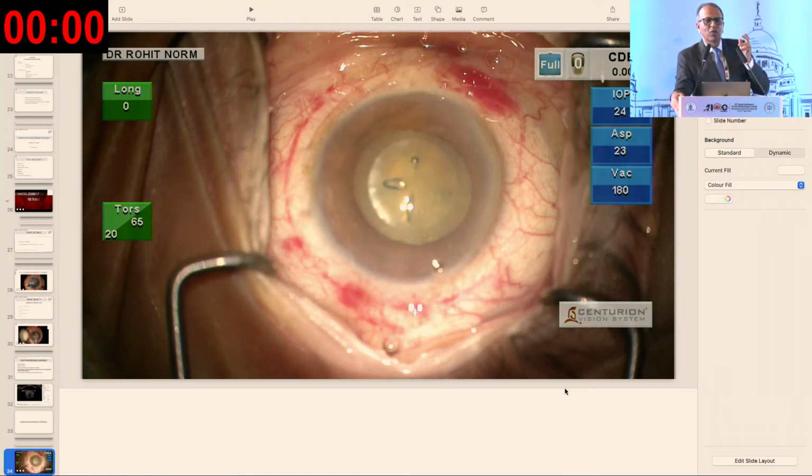there are cases around when you suddenly say that I started with phaco and suddenly the nucleus went behind and there is no fault of mine. Well, the idea is at times there is a PCR with the high fluidics, with high gushing of fluid, the nucleus falls behind. Low fluidics, aptly used, can save your day.